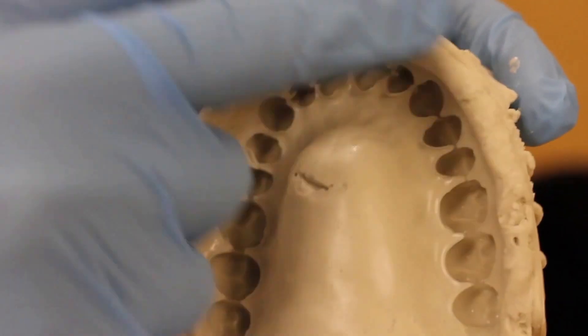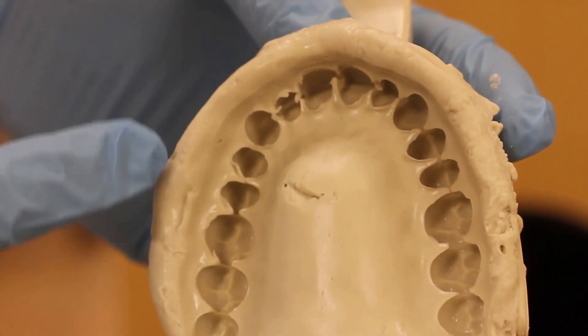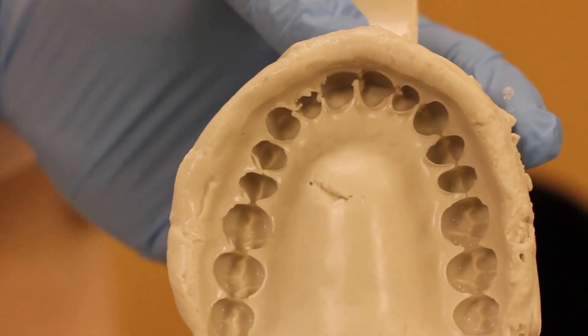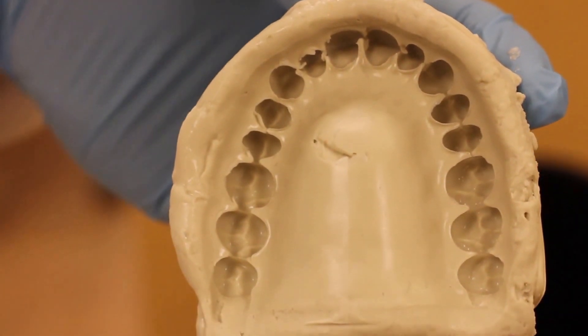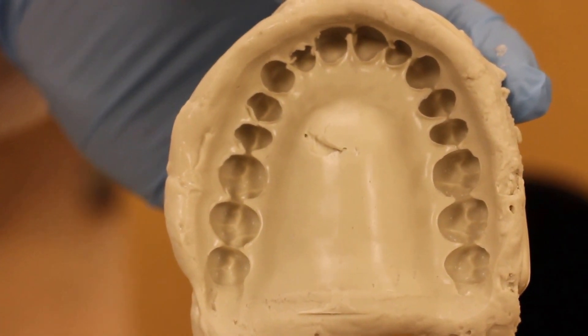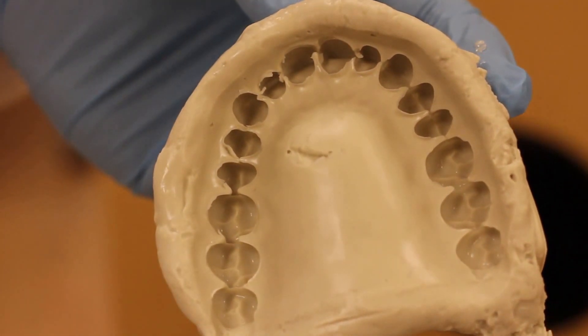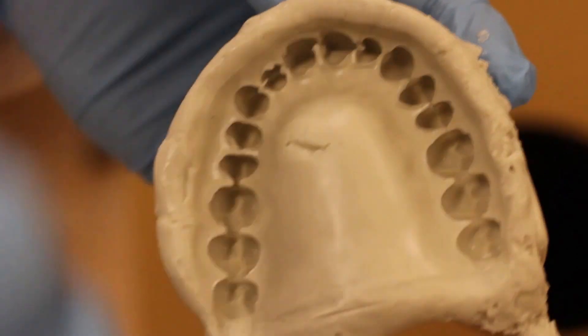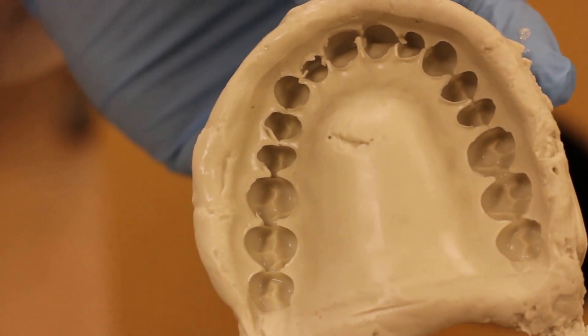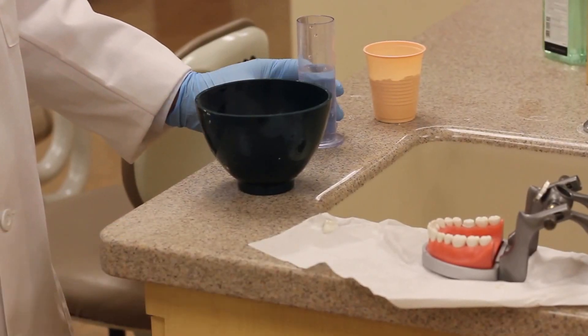Obviously the vestibule would be nice to capture but that's most critical for edentulous impressions because we often are making a custom tray to those vestibules, whereas a fixed impression you're most interested in the biting or occluding surfaces. Alright, so I want to show another example with the lower.